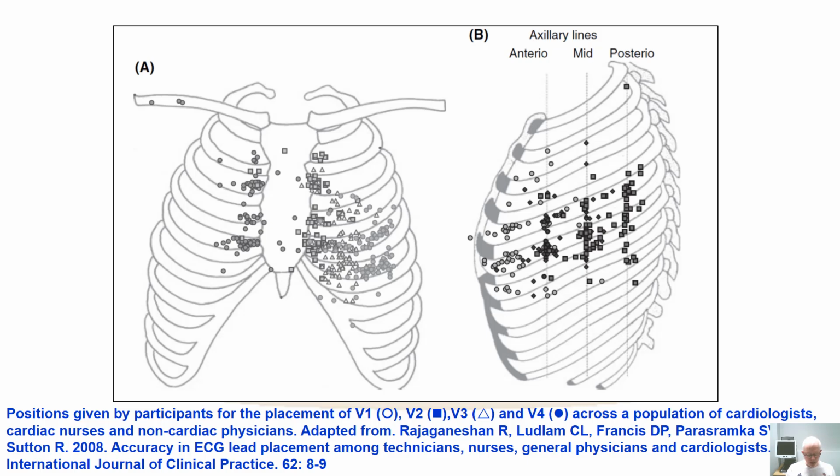Now, bearing that in mind, and bearing in mind that the heart of this individual, this case study they did this on, won't have moved, you can automatically understand that depending on where those electrodes are placed, you're going to get very different ECG responses. So what does this really look like?